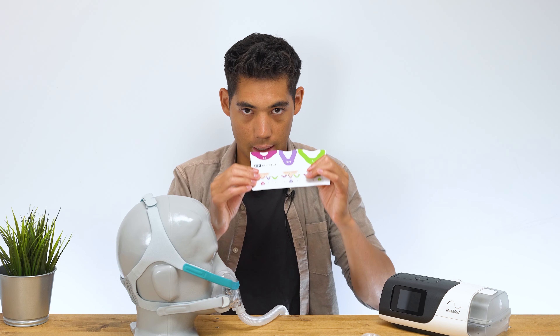We have the bridge where everything straps onto, with the Fisher & Paykel logo there, and then the tube connects to our ResMed AirSense 11. The tube just kind of breaks apart and goes back together. Very simple.